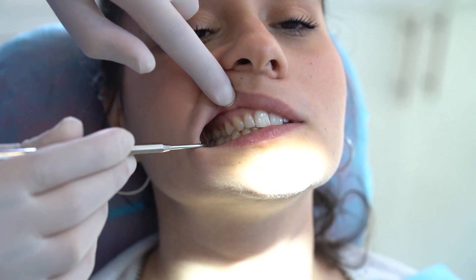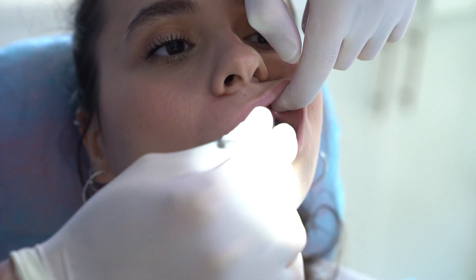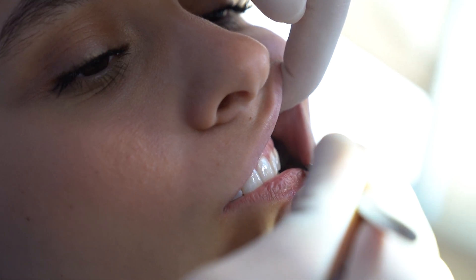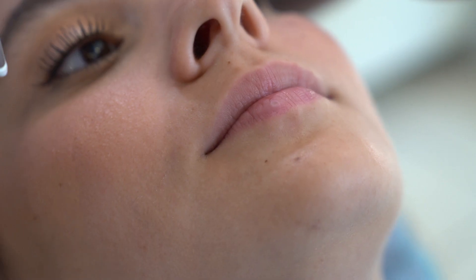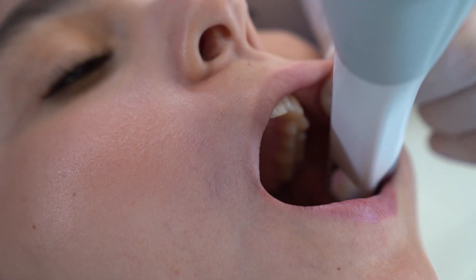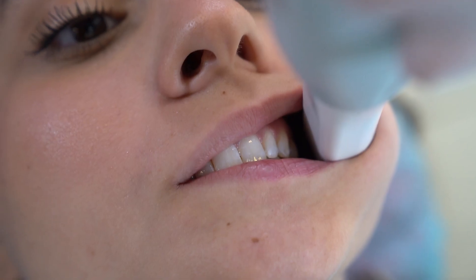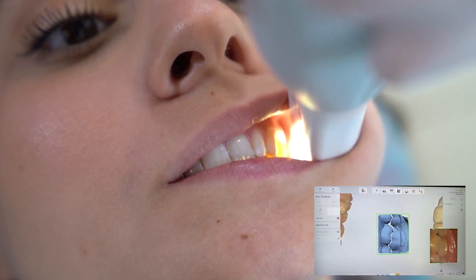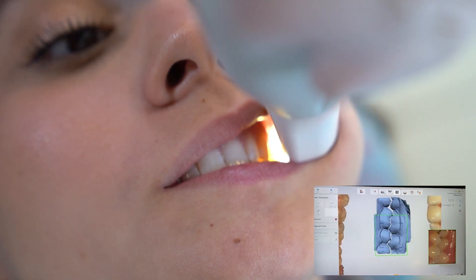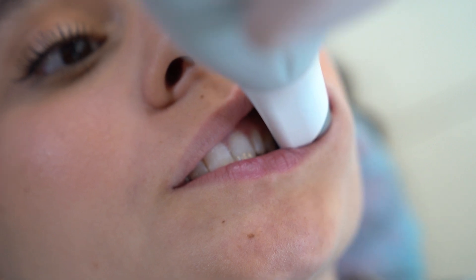When both upper and lower scans are captured and inspected, it's time for capturing the bite. The correct bite should be inspected before starting the scan. Ask the patient to open wide, insert the scanner tip against the buccal cheeks facing the teeth perpendicularly, then ask the patient to bite and start the scan capturing three to four teeth in centric occlusion. Do the same for the opposite side.